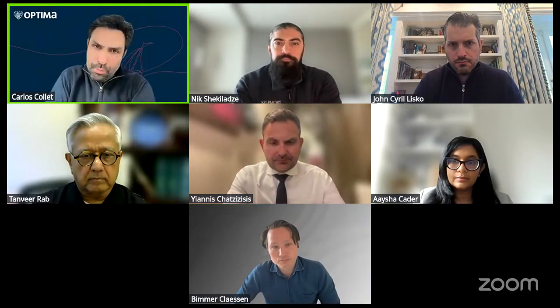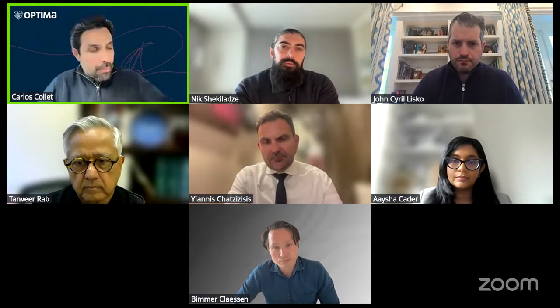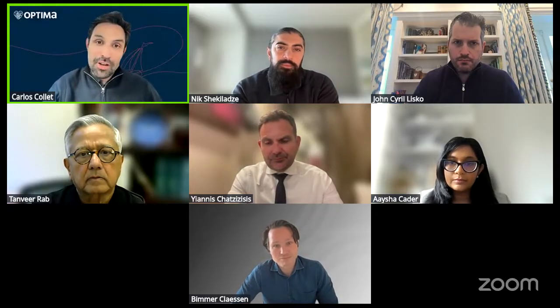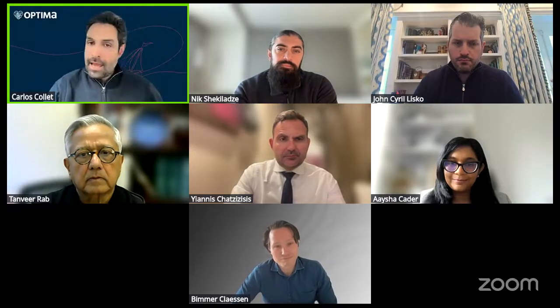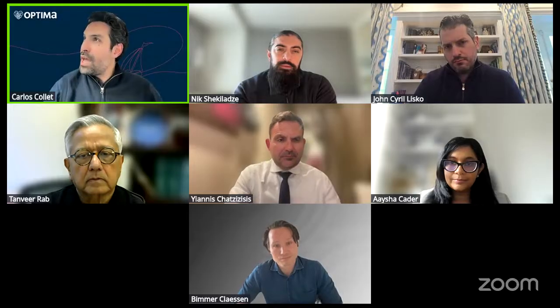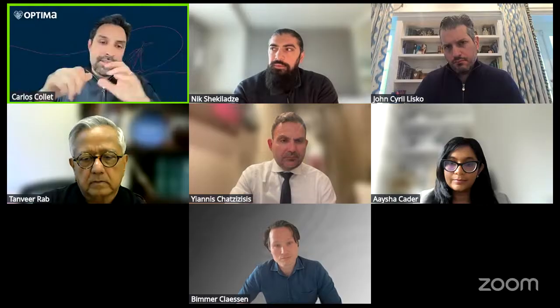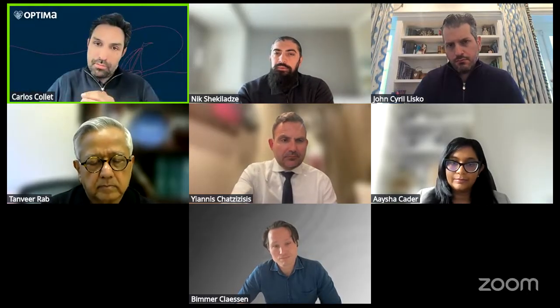Yeah, so Bimer, thank you. There are two super relevant questions there. One of the reasons that I like to do clinical trials is because you always learn something that makes you practice in a better way. One of the big things that we learned from P4 very early on was that the way we were doing the scans, we were doing rule-out scans. And if you do rule-out scans, you cannot see what I showed you in the pictures before.